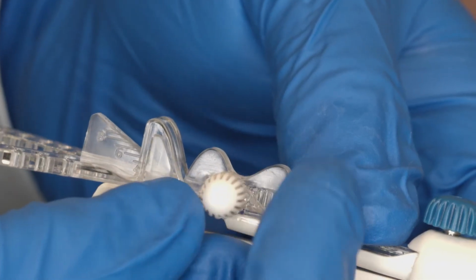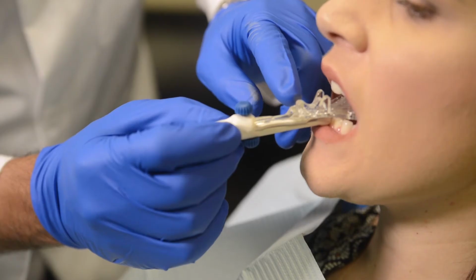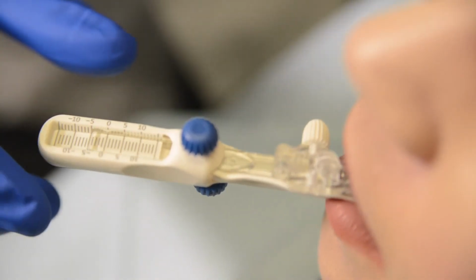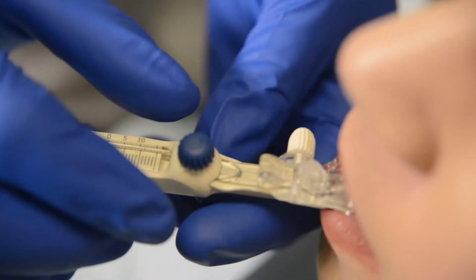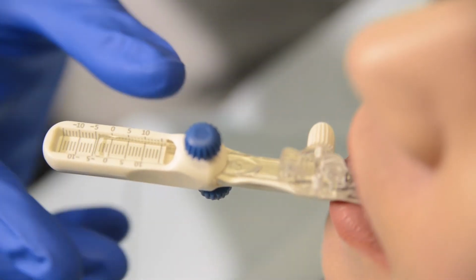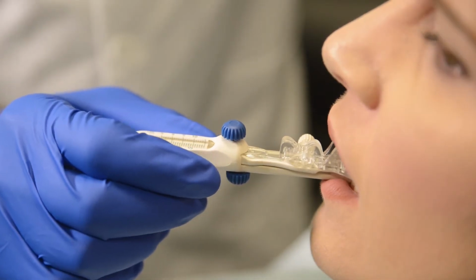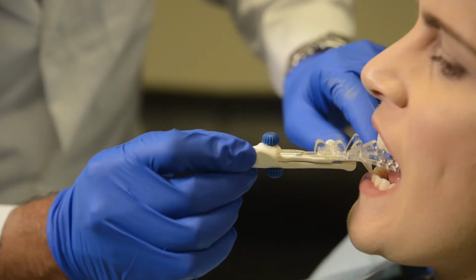Step 4. Tighten the ramp screw to secure the ramp and loosen the upper screw to unlock the bite fork. Instruct patient to move mandible to centric position and record the value indicated on the ruler. Instruct the patient to move mandible to full protrusion several times. Record the maximum value achieved as indicated on the ruler.